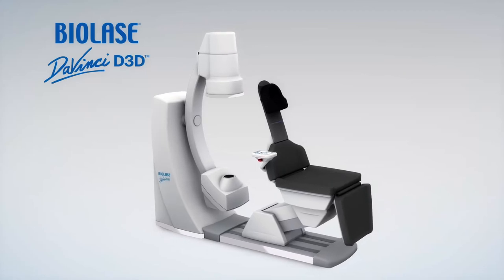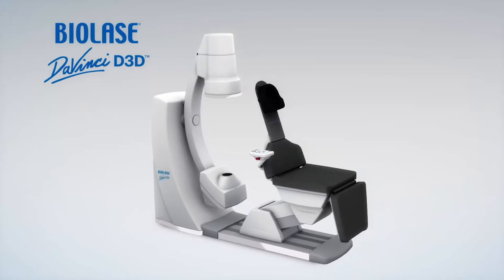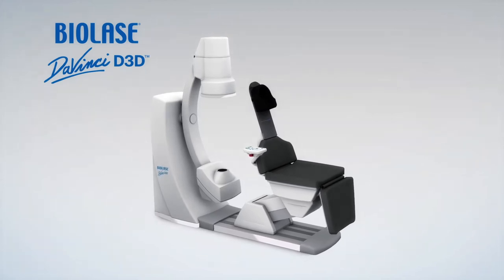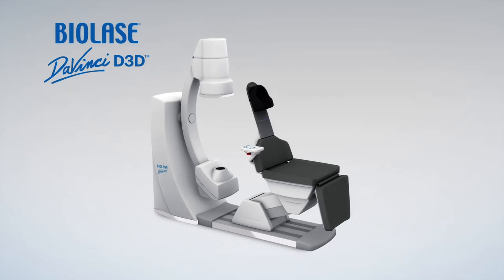The reclined patient position provides maximum stability, image quality, and patient comfort. Multiple fields of view allow for ultimate flexibility in diagnosis and treatment planning.